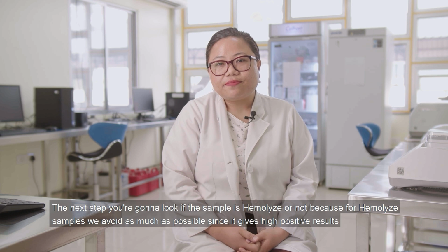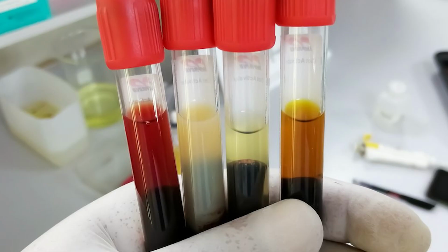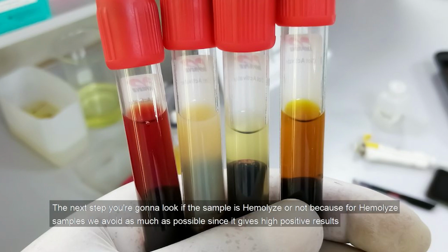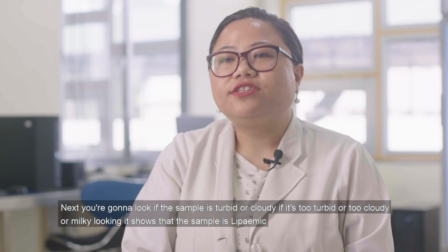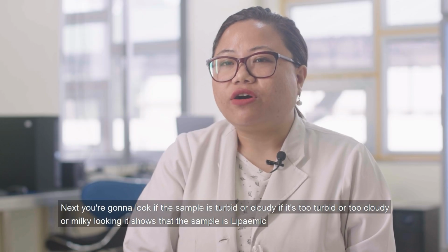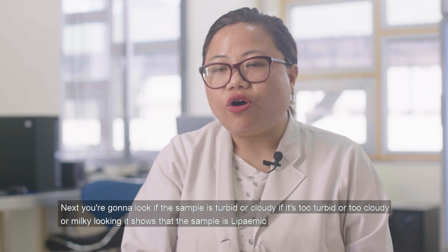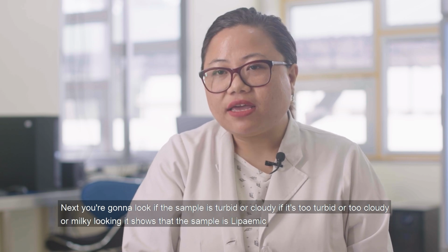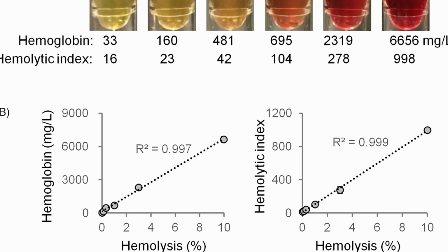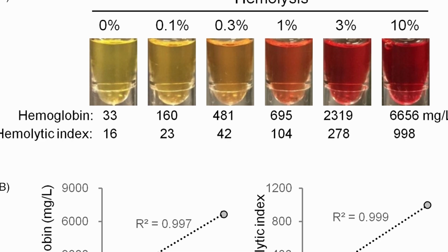The next step, you're going to look if the sample is hemolyzed or not, because hemolyzed samples we avoid as much as possible since they give high false positive results. Next, you're going to look if the sample is turbid or cloudy. If it's too turbid or too cloudy or milky looking, it shows that the sample is lipemic, which cannot be used for such a test because it gives false positive or false negative results.